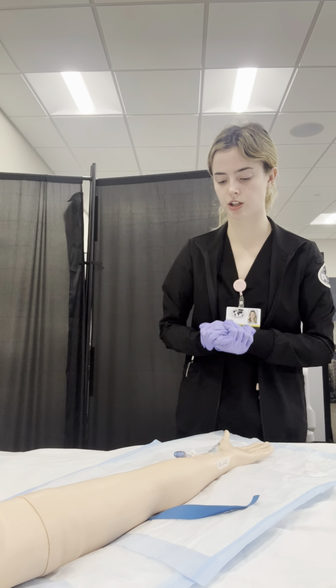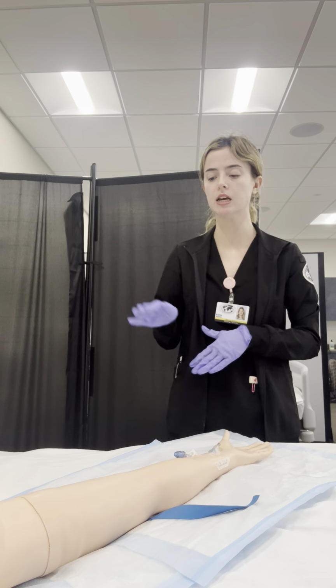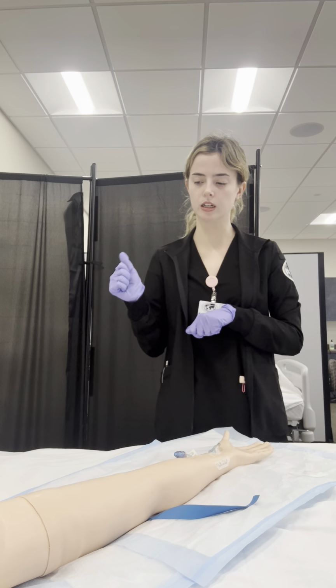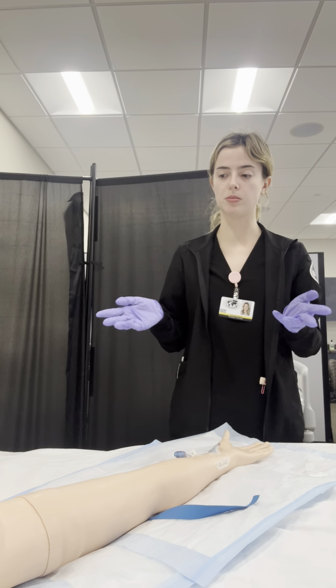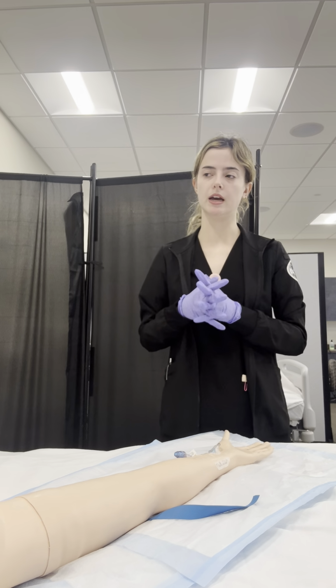The extension is secured. Insertion is taped down with the transparent dressing. So I would lower the bed back all the way, make sure side rails were up, and instruct the patient to let me know if they experience any complications with the IV. And then I would take off my gloves and go document.